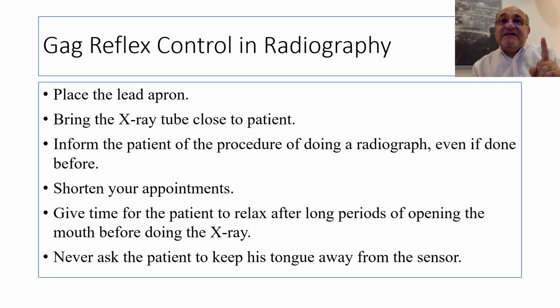I think you've all come across this: when you ask your patient to move the tongue, the tongue will involuntarily move, and sometimes you will not be able to complete the treatment. So please forget the tongue and never ask the patient to place the tongue away from the area of your work.